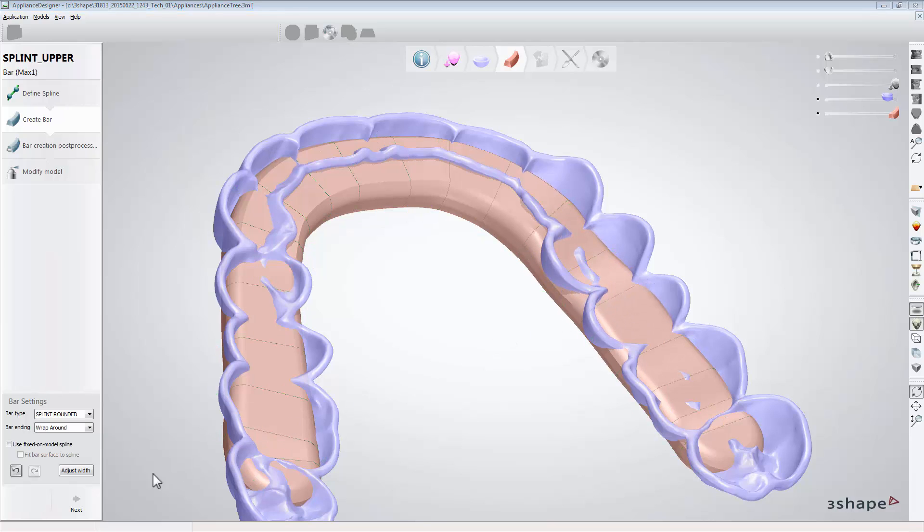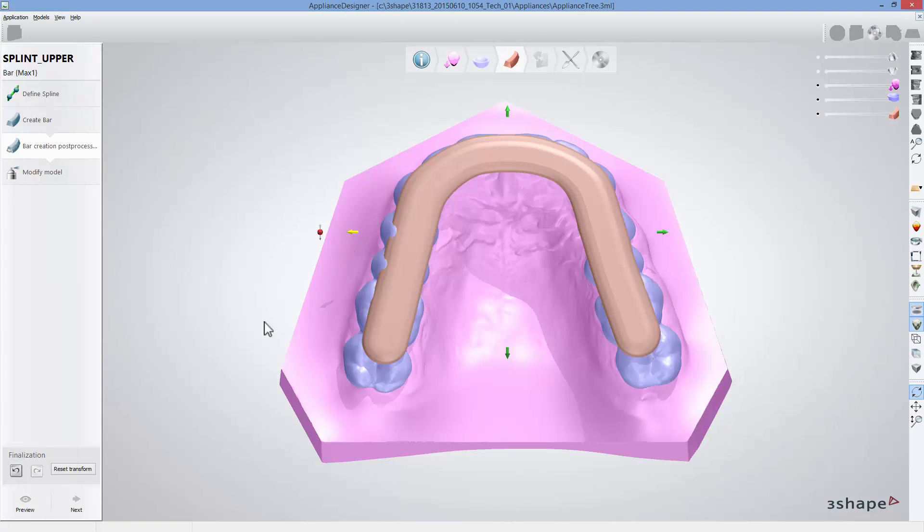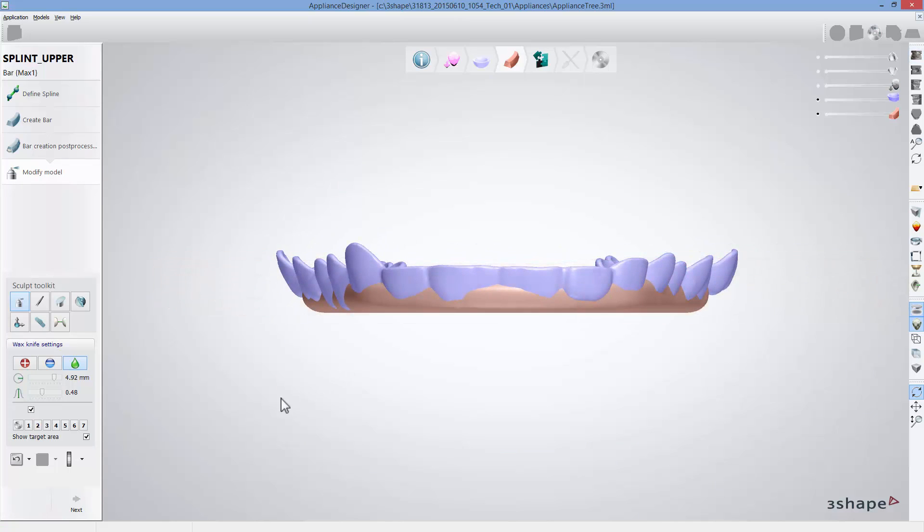When done, click next to go to the step where you can shift the whole bar design or rotate it. At this step you can make some adjustments to the bar design using sculpt toolkit.